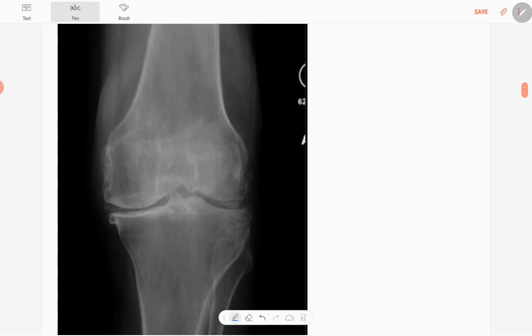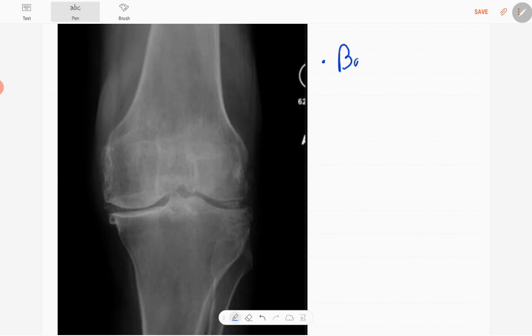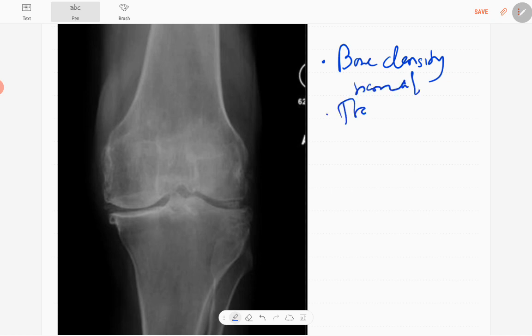You can figure out few abnormalities. The bone density is normal and the trabecular pattern is also normal.